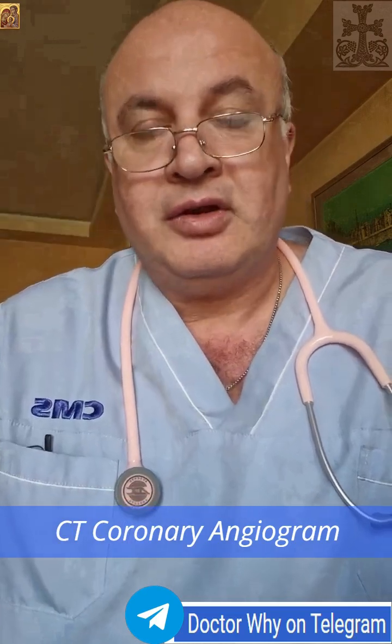And there are some very interesting articles we've got that say we can find unstable plaques, although I don't know how much to trust them. These are the vulnerable plaques, unstable plaques that provoke myocardial infarction. We know that unstable plaques are the problem. This is the problem. Okay? Stable plaques are not a problem at all. So, it's a non-invasive, high resolution, 3D look at the coronary arteries.